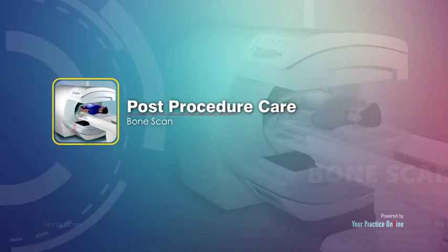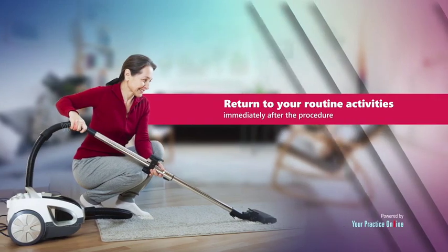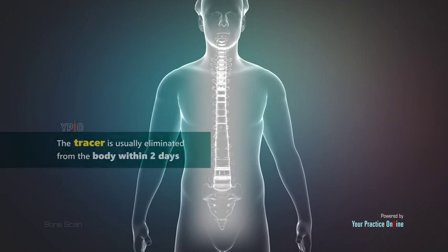Post-procedure care. You can return to your routine activities immediately after the procedure, as no follow-up care is needed. The tracer is usually eliminated from the body within 2 days.